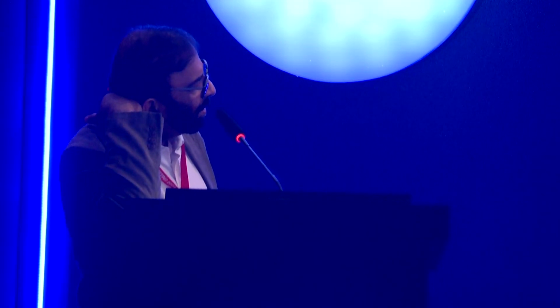Then we went caudal and put in a 2.25 by 18 Xience, and that's where we're at right now. So our plan now is we've gotten our LAD CTO opened up. We have the mid LAD stented back to the proximal. We've got the circumflex stented distally.